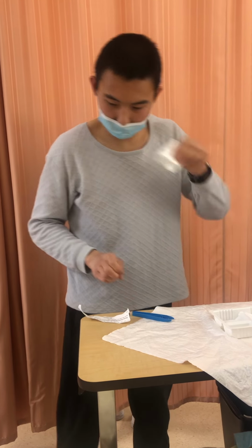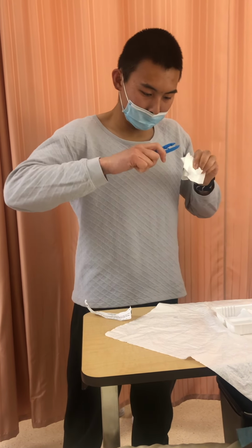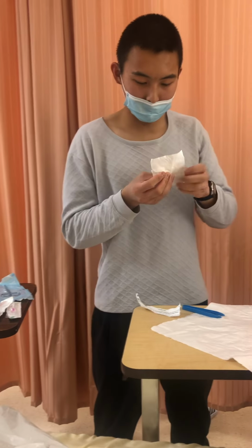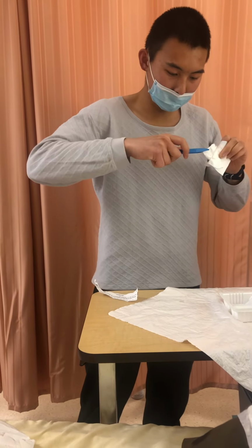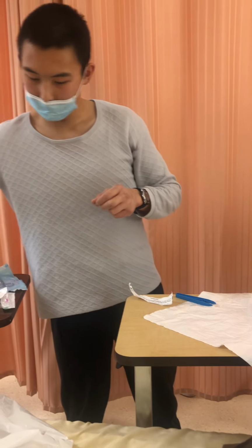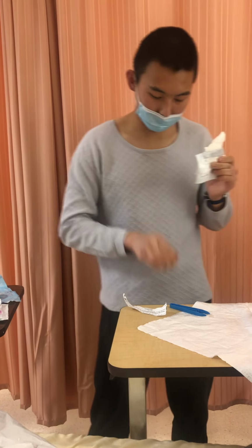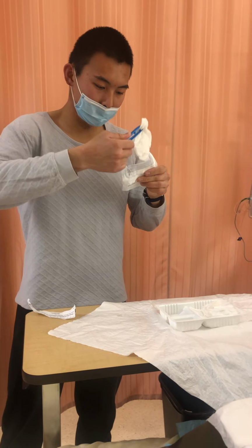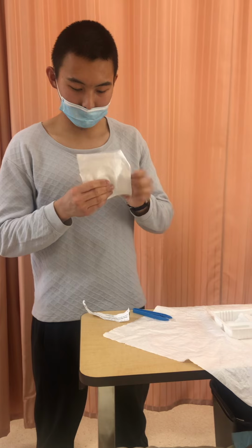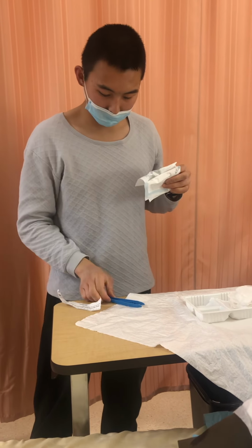So I'm going to set up my sterile kit. And I'm going to add in 4x4s. So we have a trash bag. I have one on the floor here, but I'm also going to put one here at the edge of the bed, just for safety. And then I have an extra sterile area, which I don't really think I'm going to need, but I'm going to set it up right there, just for the sake of having it.